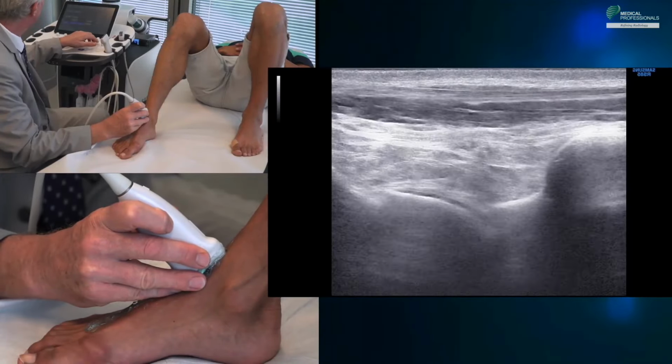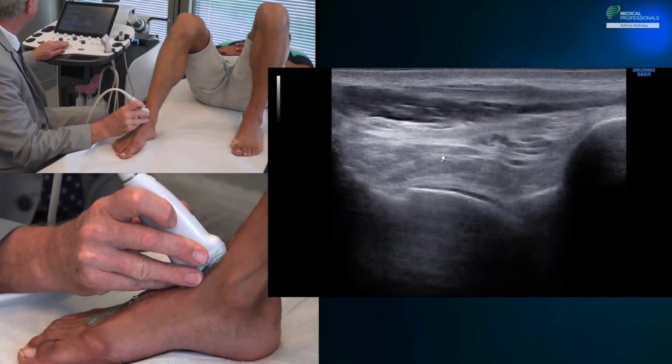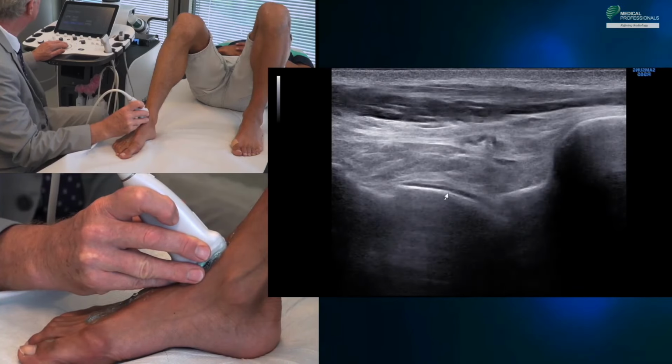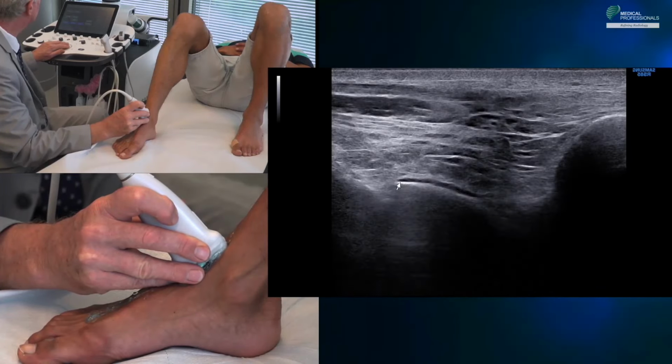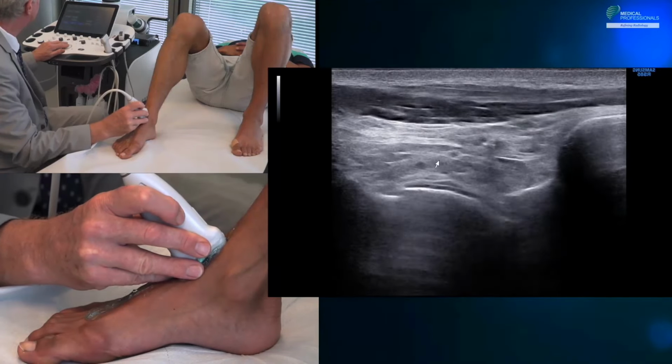We make a sagittal section that will pass through the articular capsule. We can clearly see it here. It closes this dorsal recess with here the dome of the talus covered with its cartilage, and here the distal epiphysis of the tibia.